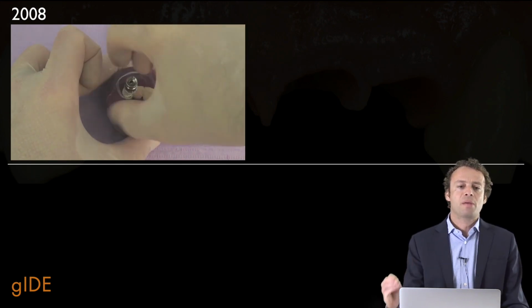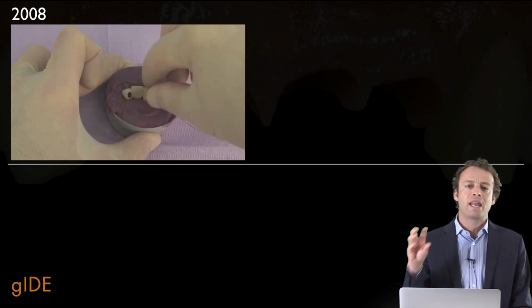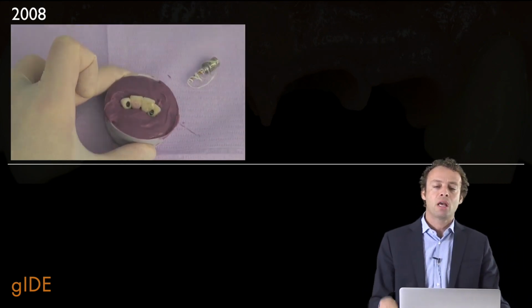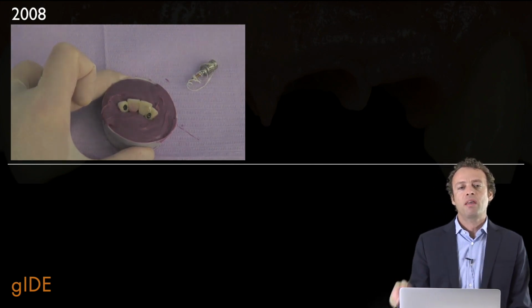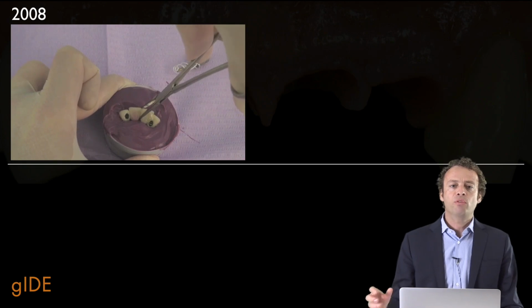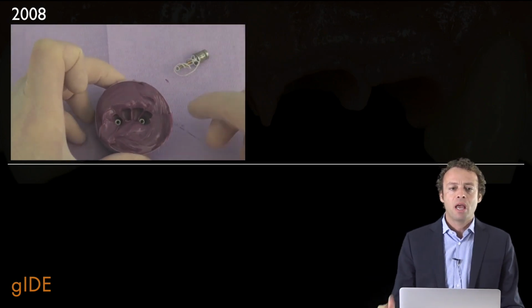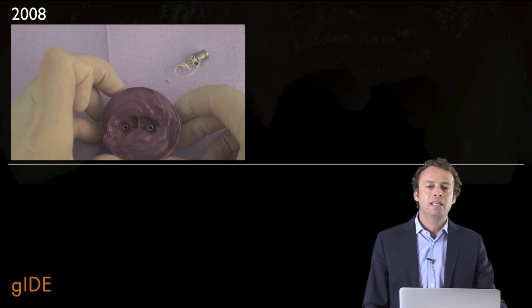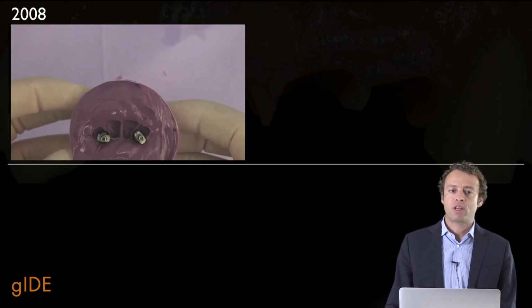It's the same concept that we have seen for the single tooth replacement. I want to recreate the negative shape of the temporary in the subgingival portion. Once the polyether has completely set, I unscrew and remove the temporary. And we can see how we have exactly the subgingival profile of the temporary restoration.